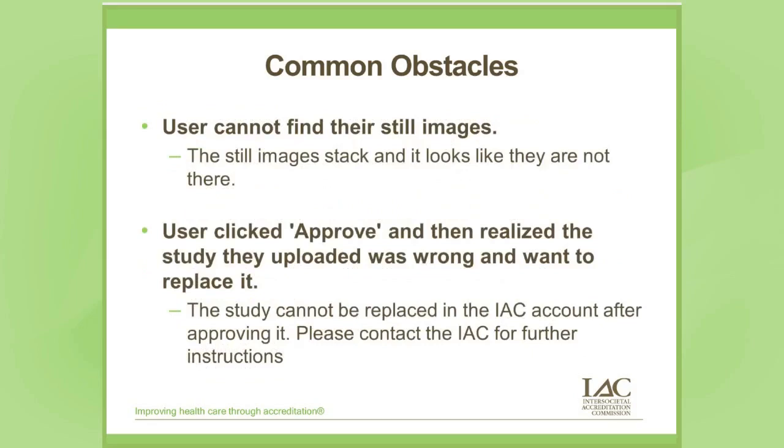User cannot find their still images. The still images stack and it looks like they're not there. So you would have to flip through those one by one. Again, the user clicked approve and then realized the study they uploaded was wrong and they want to replace it. The study cannot be replaced in the IAC account after approving it. You would need to contact us for further instructions.